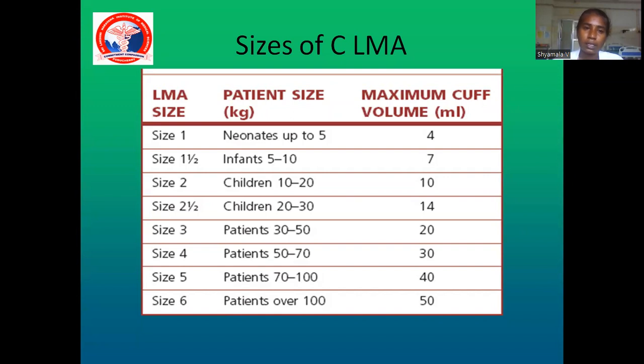It is used for patient weights of up to 5, 5 to 10, 10 to 20, 20 to 30, 30 to 50, 50 to 70, 70 to 100, and 100 and above. Similarly, based on the size, we have to inflate the cuff volume.